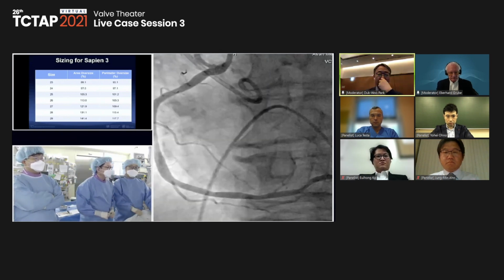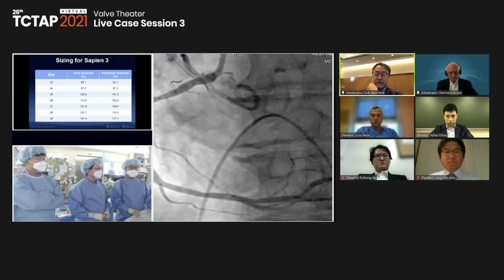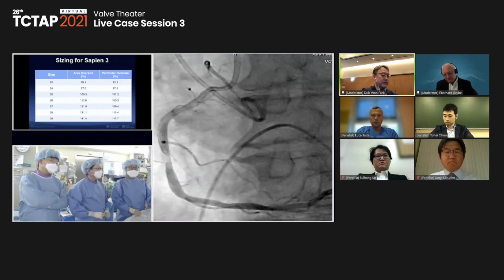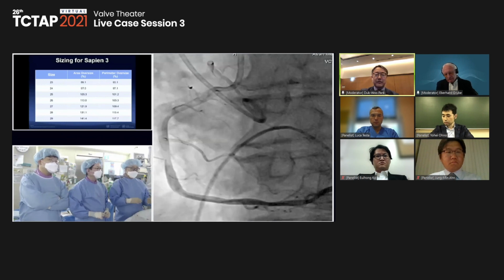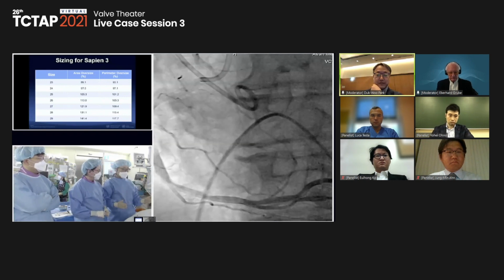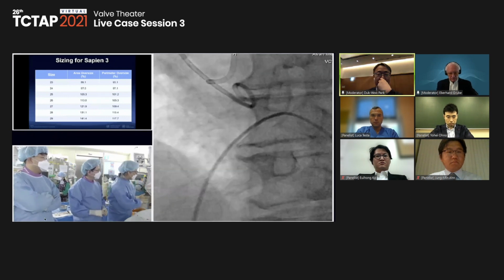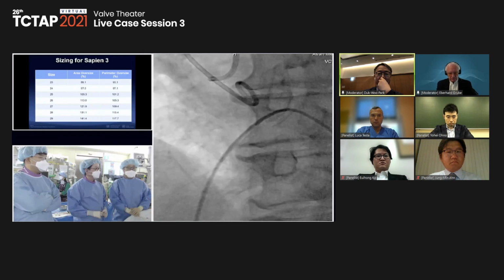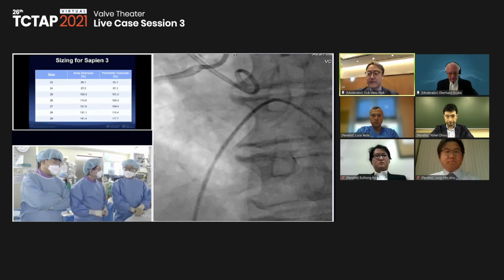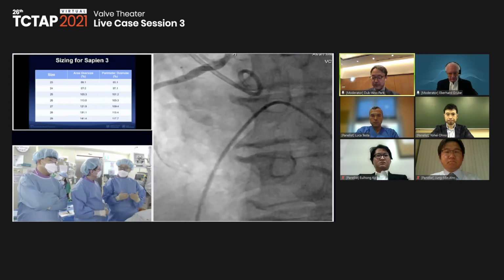Our team is a leading team in South Korea, and we usually do 200 cases annually. We have almost done 1,000 cases of TAVR procedures. To summarize our routine practice, more than 95% are done with MAC, monitored anesthetic care, with full support from specialized anesthesiologists, and just for high-risk patients, the 5%, we sometimes do general anesthesia.